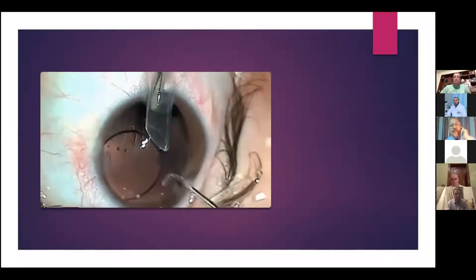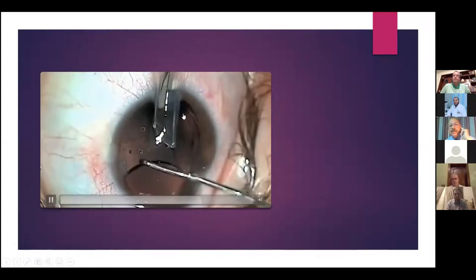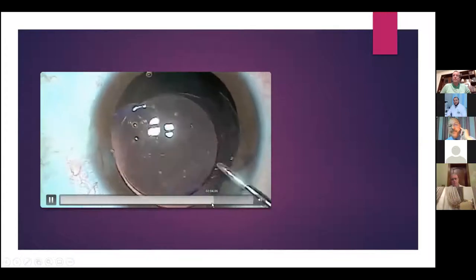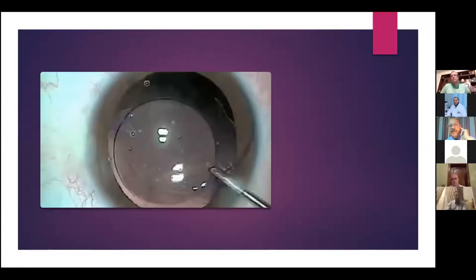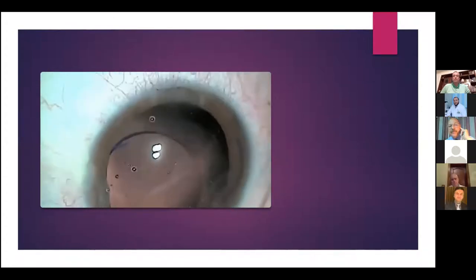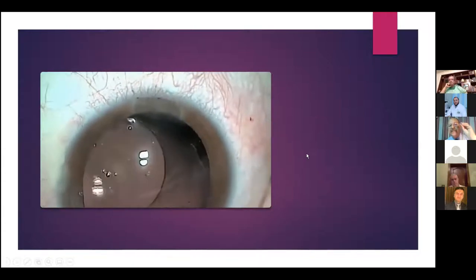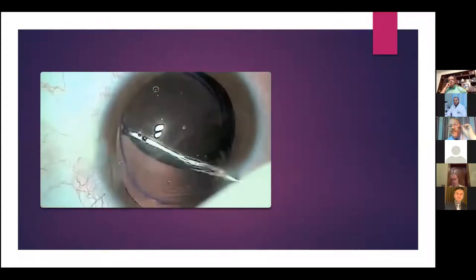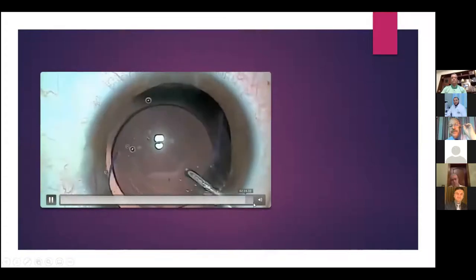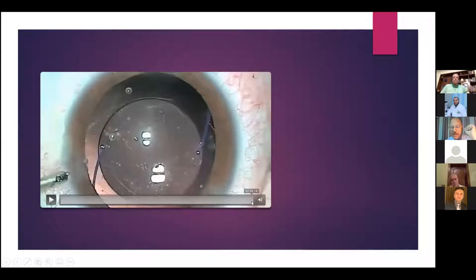Yeah, okay, go ahead. This is the IOL implanted in the bag, and in spite of the area of dehiscence, you will see the haptic is in the bag, and it can push the area of zonular dehiscence, and so you used the zonules, and you didn't lose the zonules in this case. This is the end of the procedure. It is centralized without CTR. Another case.